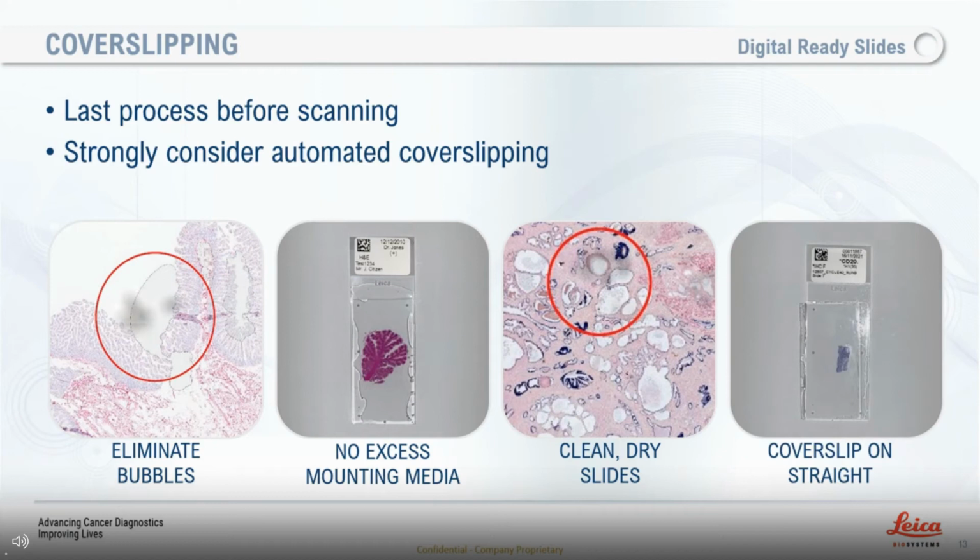Finally, you need to make sure that your cover slip is on straight. And again, this is due to the tolerance that the different scanners will have in relation to movement of the slide or the slide trays within the scanner.